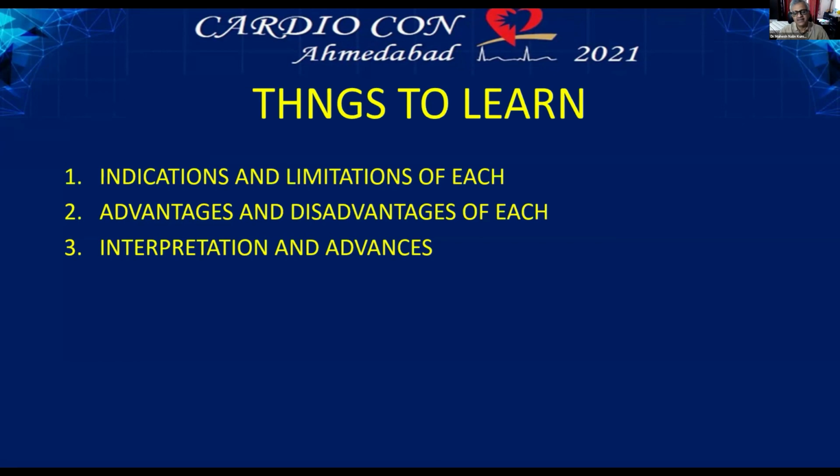So you can, A, identify the position of the lesion by co-registration, B, identify the lesion extent, and C, identify simultaneously which is the lesion which needs to be tackled. So that is the new one that has come. When it picks up, it will be a challenge. But OCT is not far behind. OCT has also come up with co-registered OCT with IFR. So the newer modalities of imaging, whether it be IVUS or OCT, have got integrated IFR in them, and that is the way forward.